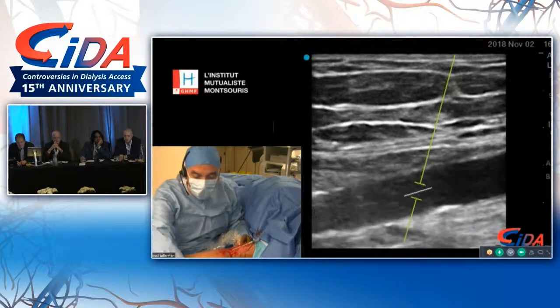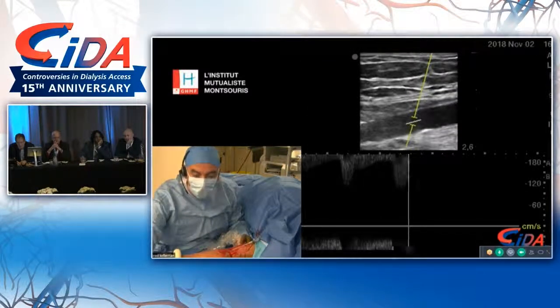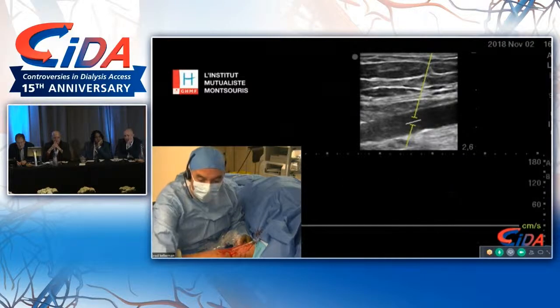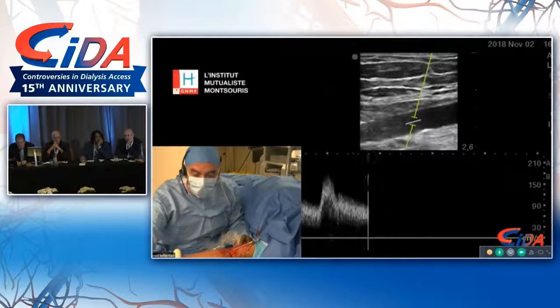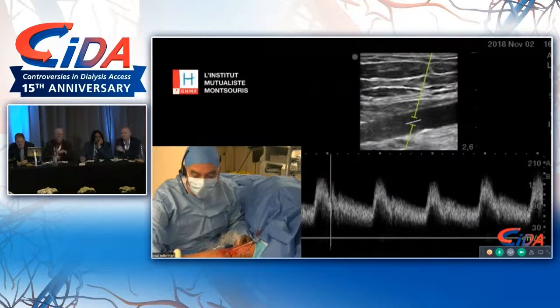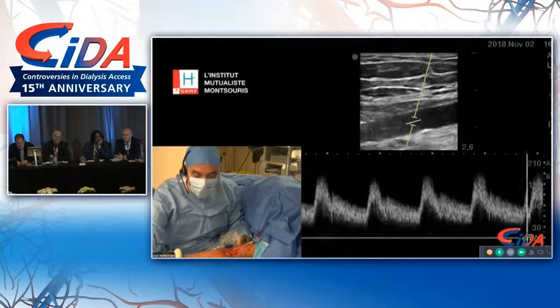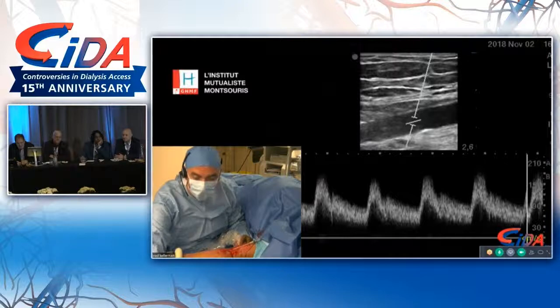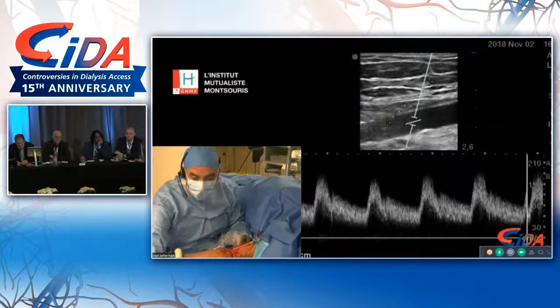So what we do here for all our cases, we give an axillary block, and we also give some sedation. Especially when you do a live case, you don't want the patient to start singing. Generally, we try to give them some sedation, and they all get an axillary block. To be honest, the axillary block is more for the vasodilation and less for the actual pain, because the truth is that for the pain, you can easily do it with local anesthesia, no doubt about it.